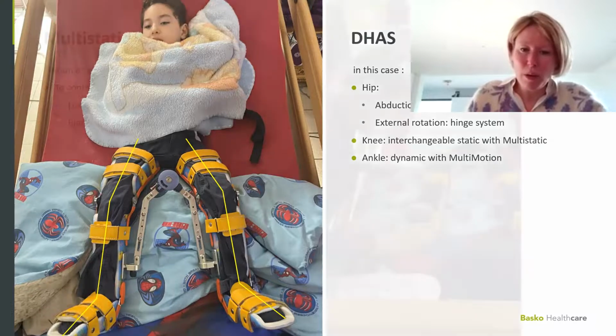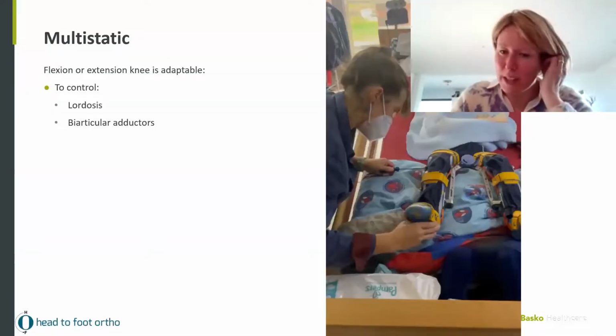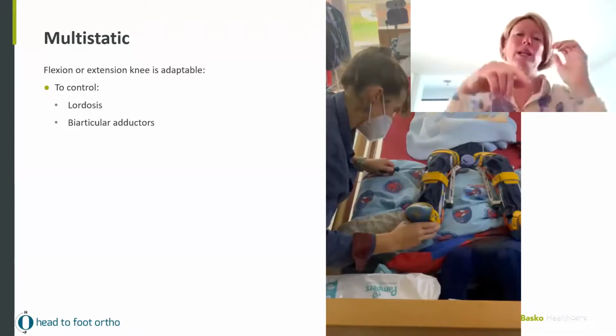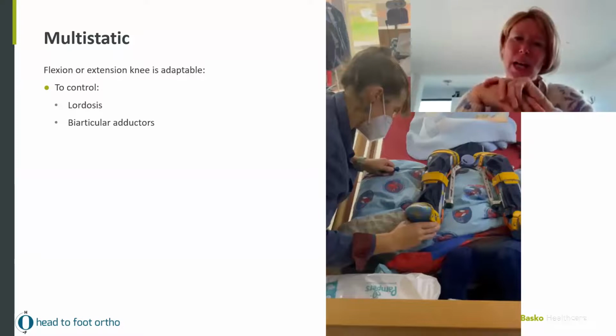So what can you do with it, and it's beautiful, I love the combination of multistatic with the hip abduction system, because you can say, well, in the beginning, I don't want the biarticular adductors to interact.